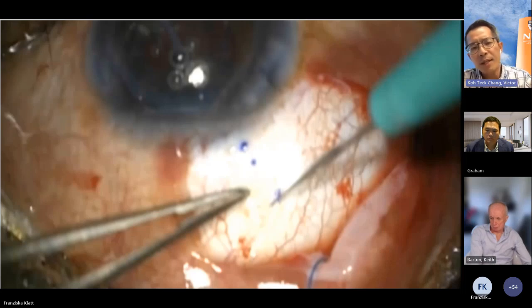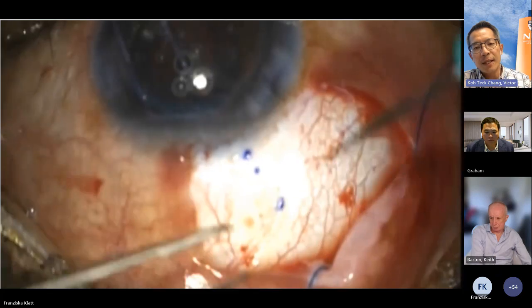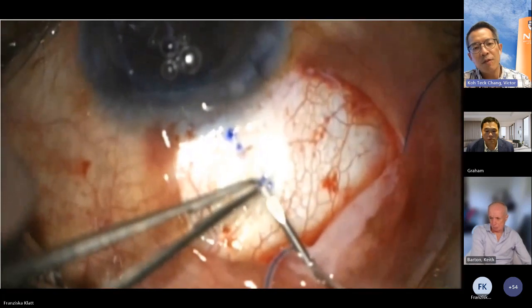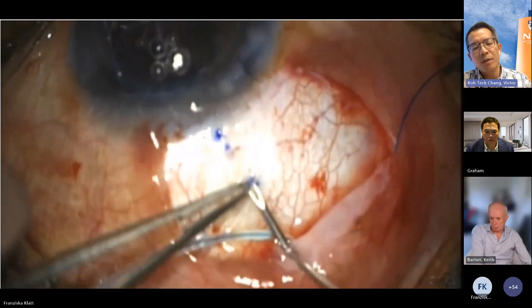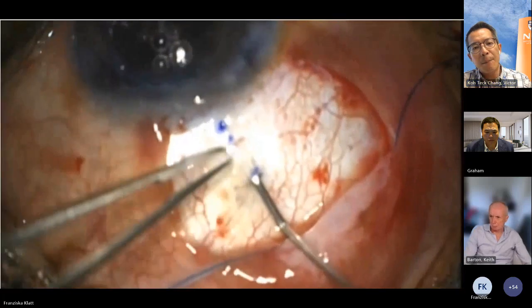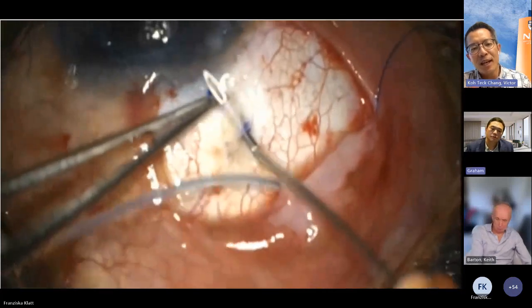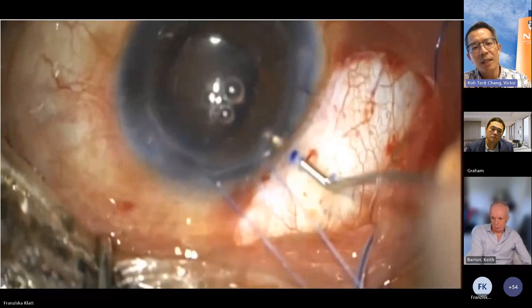So I thought maybe another way is to reduce the micro movement of this tube and try to get it intrasclerally for a longer part of the course of the tube. Can you play the video? So what I do is that I measure about 3.5 to 5 mm of tunneling using a 25 gauge needle, and I create that sclera cuts to allow me to gauge the depth better. That's the 25 gauge needle. Pardon the resolution is not as good, and that is the 25 gauge needle going through the first tunnel. You try not to perforate the sclera, and the trick over here is to just manage to see the metallic shine of that needle, and that's the second pass.